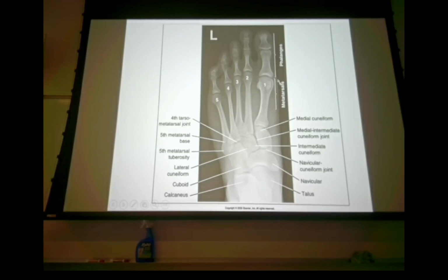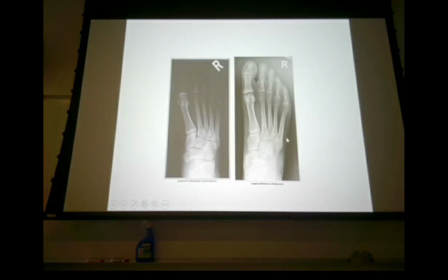So when you shoot your foot, probably one of the more common fractures I've seen has involved the fifth metatarsal. So Jones fracture, we'll again take a look at that, and there are 3 different lines starting right about here. And the pseudo-Jones fracture is an avulsion of the proximal portion. So when you're doing your lateral of an ankle, let's say, try to include enough of the foot so that we can take a look at that proximal portion of the fifth metatarsal.